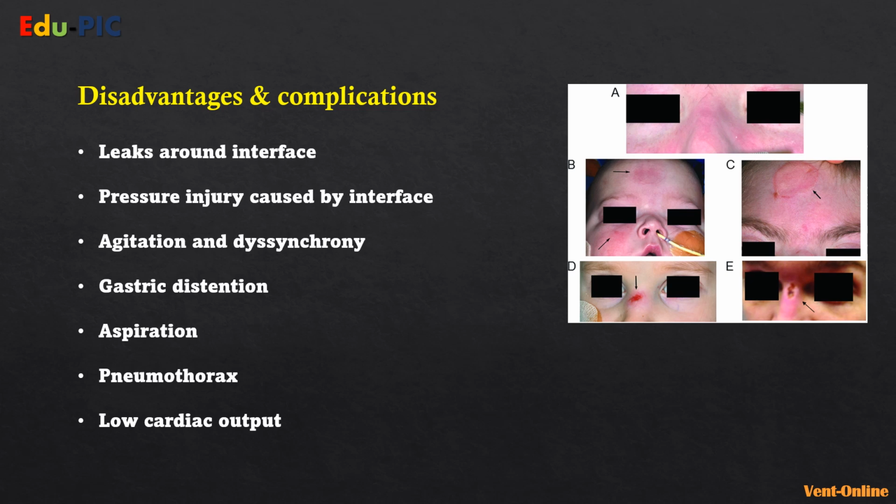And that actually is the most common complication of non-invasive ventilation, where you try to deliver the best pressure by keeping the interface really tight on the face for long periods without a break, and then basically what you get is a break in the skin itself.